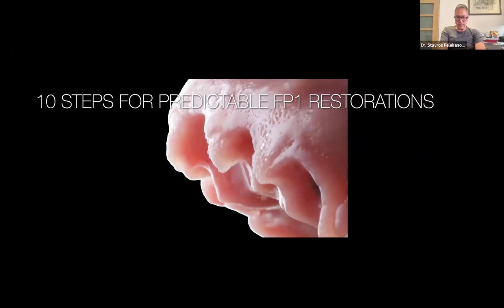As you already know, maybe some of you have seen a lecture of mine, we have created the 10 steps. The 10 steps are there because on a single implant there are maybe 1 or 2 people involved. But when we are talking about full arches, then we are talking about a lot of people that are involved.